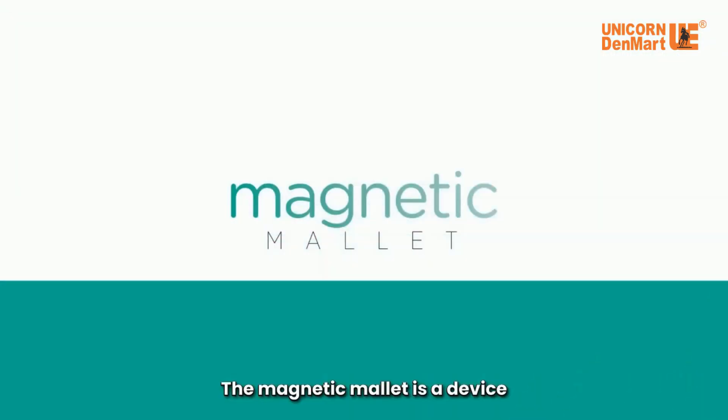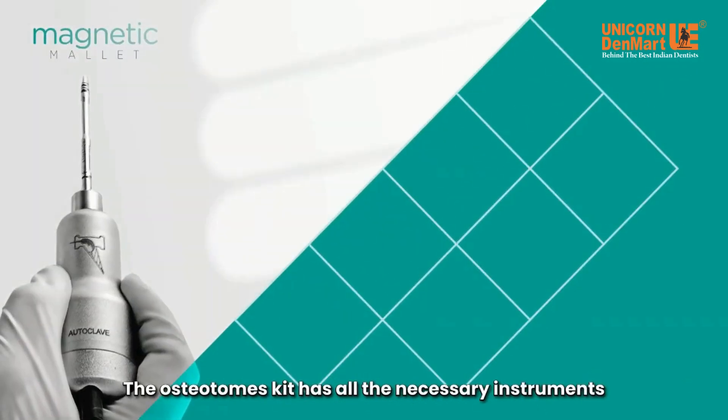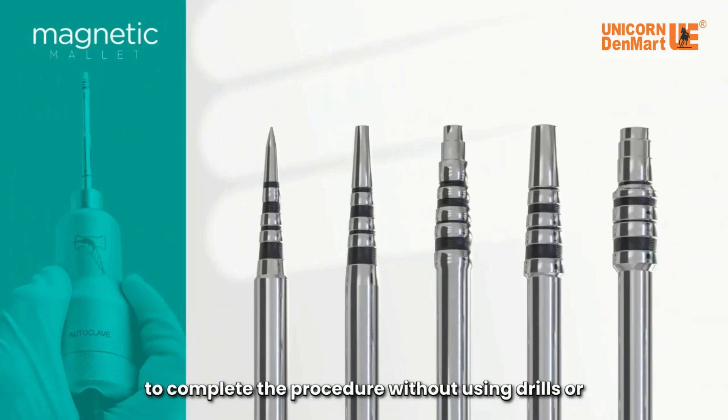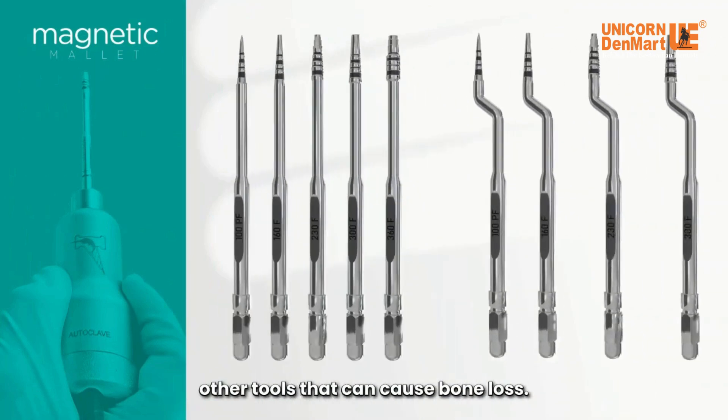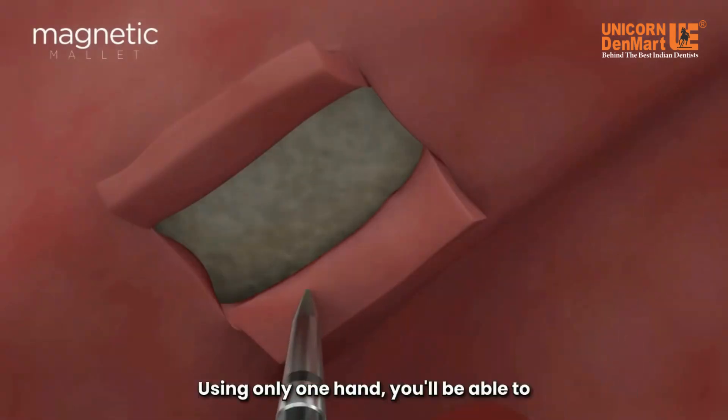The magnetic mallet is a device that simplifies the sinus lift procedure. The osteotomes kit has all the necessary instruments to complete the procedure without using drills or other tools that can cause bone loss.